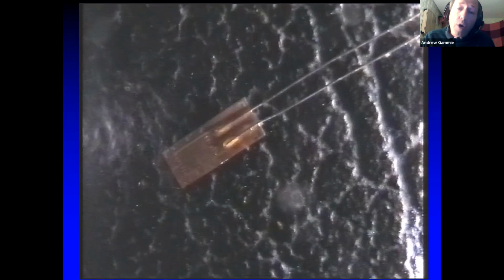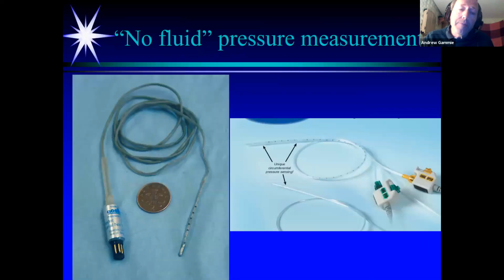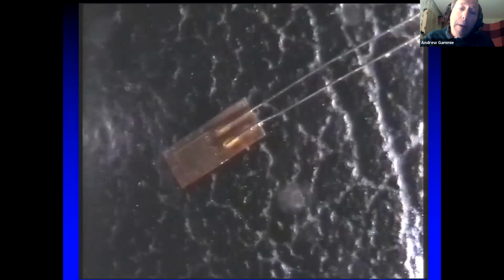And it doesn't matter what kind of transducer you have, actually. These other ones, there's an air-filled one and there's a microtip one here on the slide. They all have strain gauges in them. And however the pressure gets to that strain gauge, it's bending the strain gauge, changing the resistance of the wire that's on the gauge. I don't know if you can see on the slide here a zigzag wire going across. That is picking up the change in resistance of that wire as it bends.